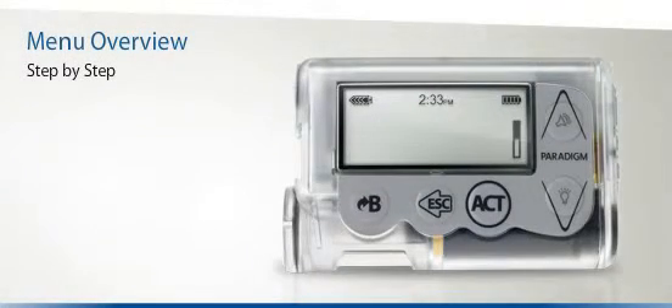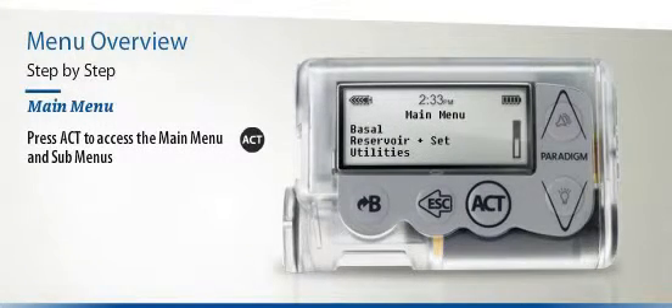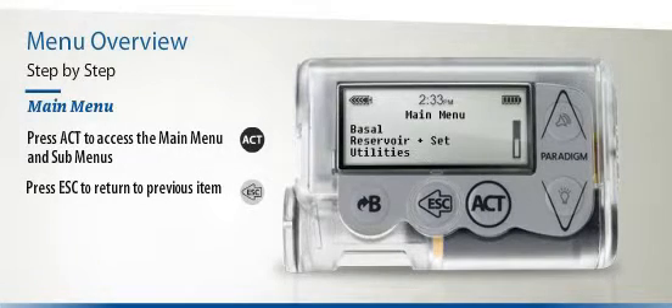To start with, let's head to the main menu, which you can do by pressing the Act button once. You can then choose a sub-menu by scrolling to it with the arrow keys and pressing Act again. To navigate back to the previous screen or to return to the main menu, just press the Escape button once.